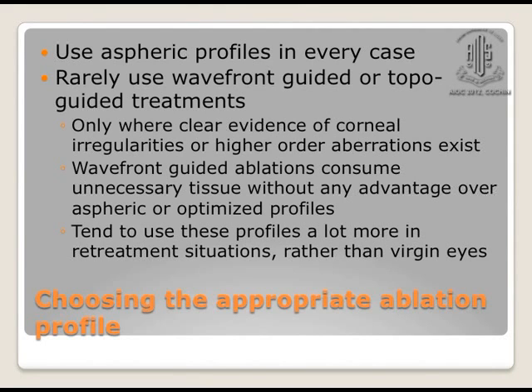So only where there is a clear evidence of corneal irregularities or higher order aberration being present would I use them. I would not really want to use wavefront guided ablations because they consume unnecessarily tissue without any real advantage over the aspheric or the optimized profiles. And I tend to use the customized mode much more when I'm treating as a retreatment.